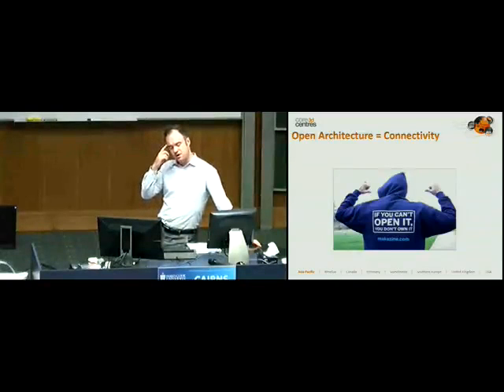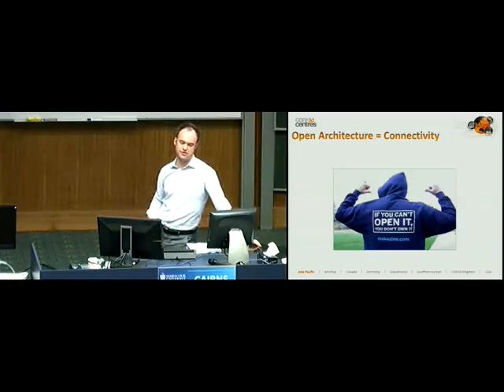The other thing I'm going to be talking about a little bit is two types of files. One's called DICOM, which you're probably familiar with. It's digital imaging and communications in medicine. It's a standard format for the storage, printing, and transmission of patient files across the internet and electronically. Most of the DICOM files you see from a CT scan or a cone beam, when you see it in a three-dimensional form, which a lot of the systems do now, basically it's using proprietary algorithms to convert the DICOM file into something called an STL file.